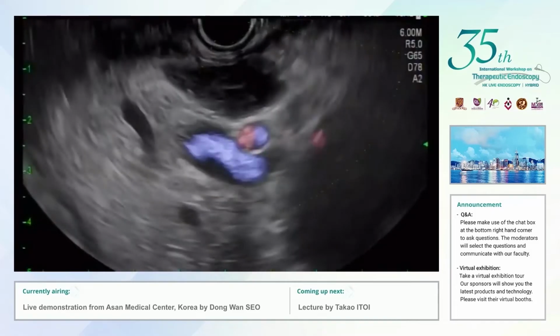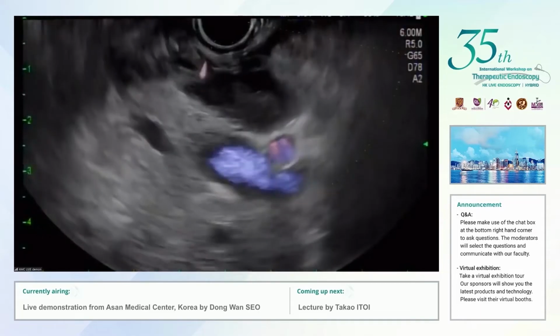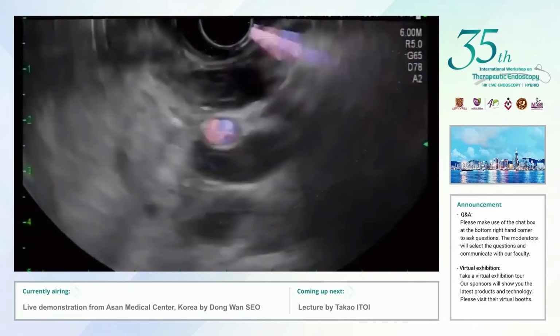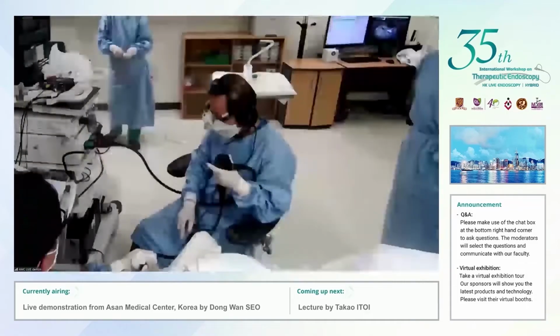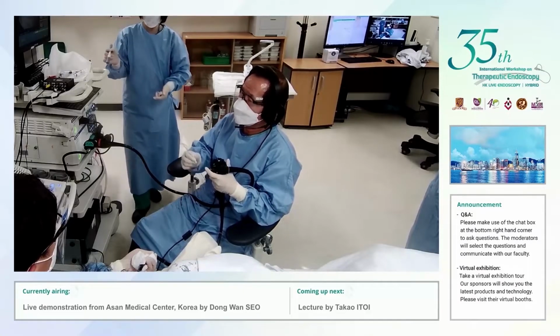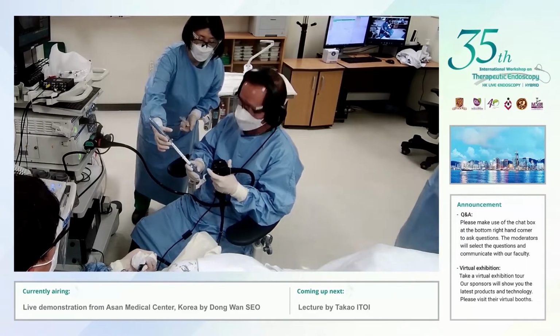And also, this is not an aseptic technique. So would it increase the chance of infection of the cyst content after you puncture? Do you regularly use antibiotics? Yes, in all the cases receive IV antibiotics when we are dealing with cyst aspiration or cyst biopsy. I think it would be wise to use antibiotics.